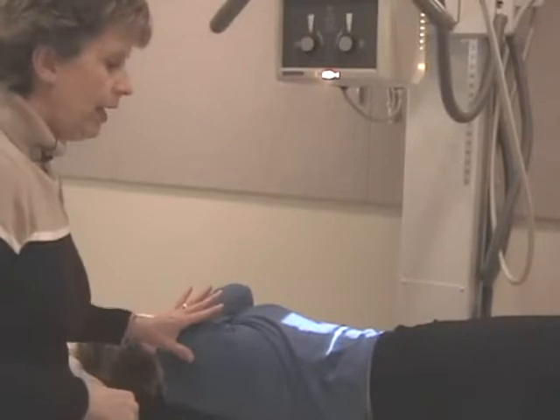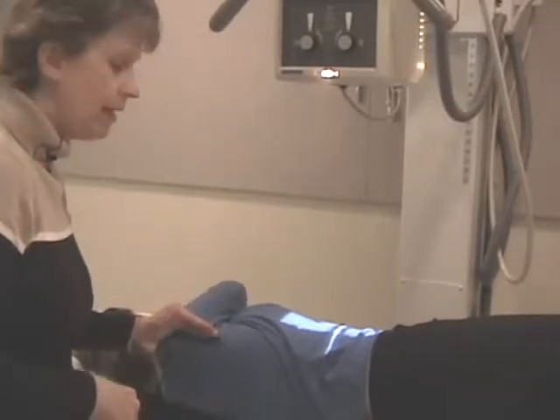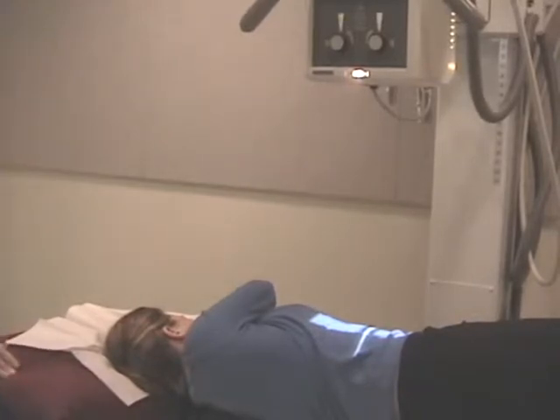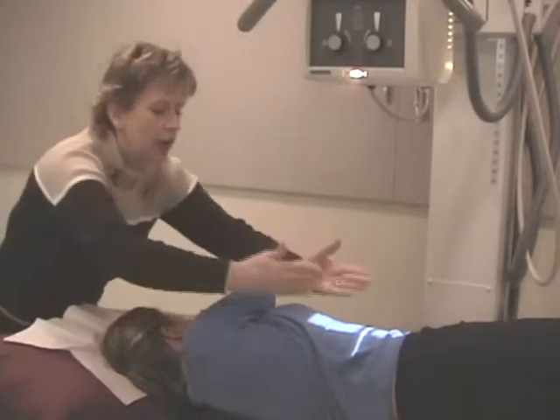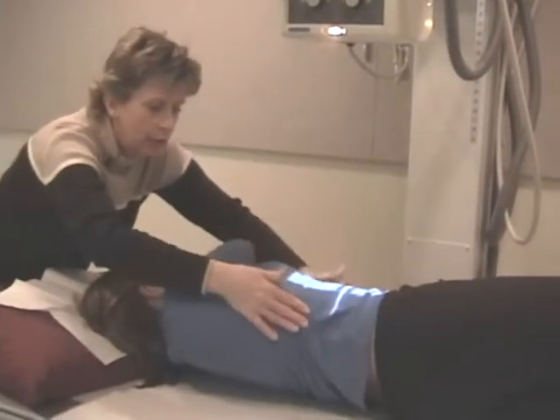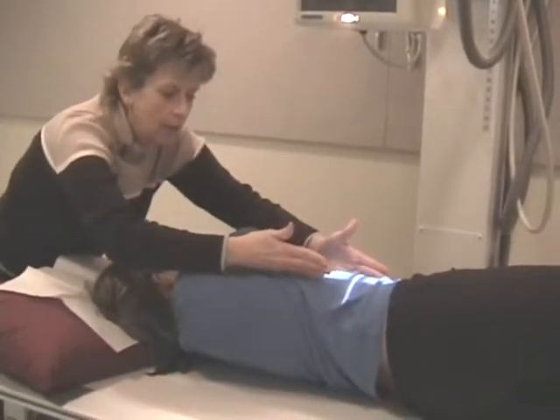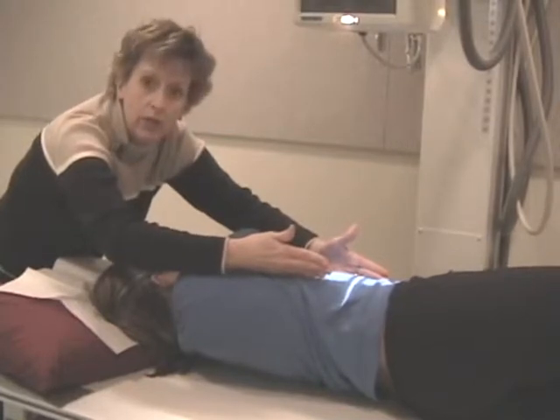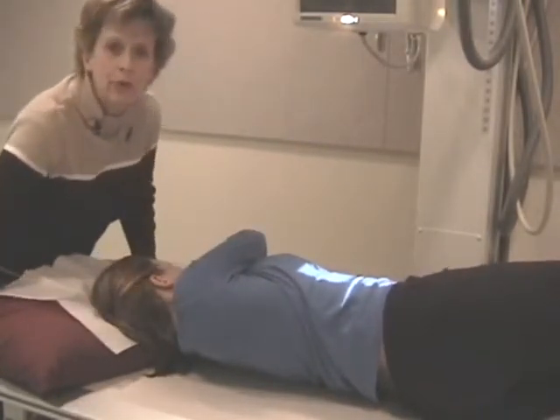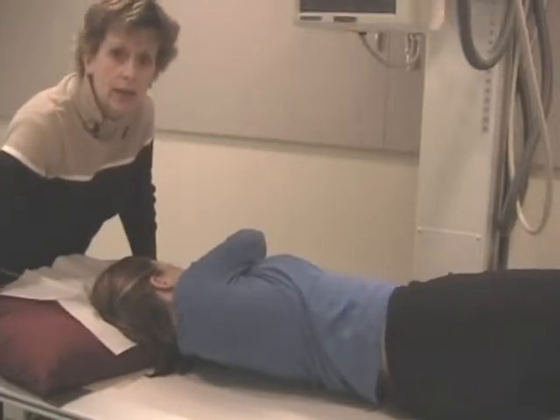Another trick with a patient size like Drea is, I can just look here from the head of the table, and the collimated box is basically centered right over that patient. Therefore, I definitely know that the spine is to the center of the film. So those are some tricks that might help you know that you actually do have the spine centered to the film.